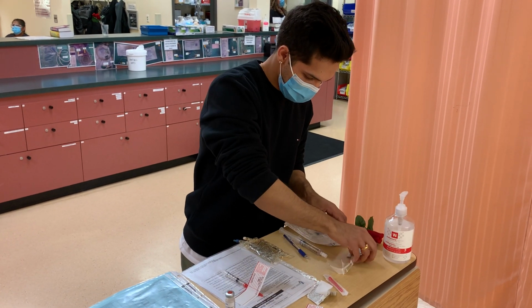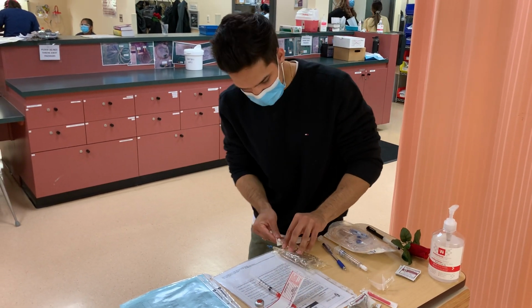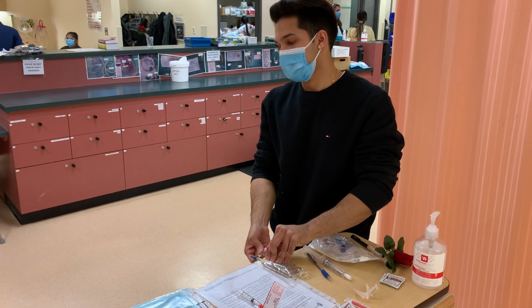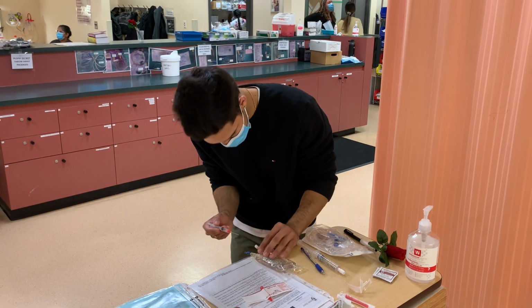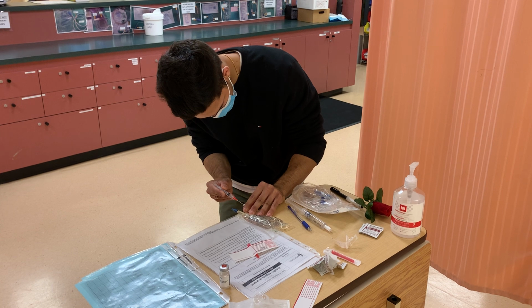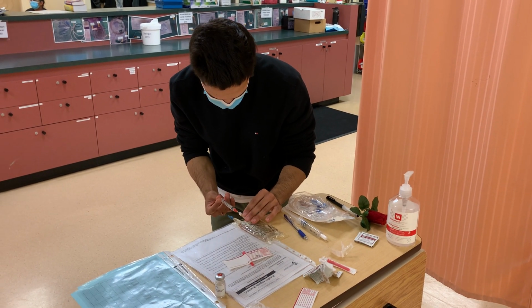Okay, I'm just going to be wiping this port for 30 seconds, letting it dry for 15. Perfect. And then now it's dry. I'm going to make sure that I take my normal saline. And I bring my 5 mLs here. I'm going to just inject it into my minibag.